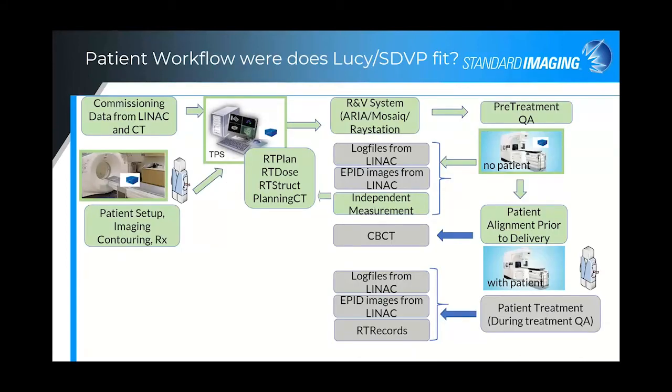So as Lucy and the stereotactic dose verification Phantom are both end-to-end Phantoms, I've grouped their workflow together here. Clearly, these Phantoms cover multiple verification aspects from the imaging system through to verification of the dose in the heterogeneous material.